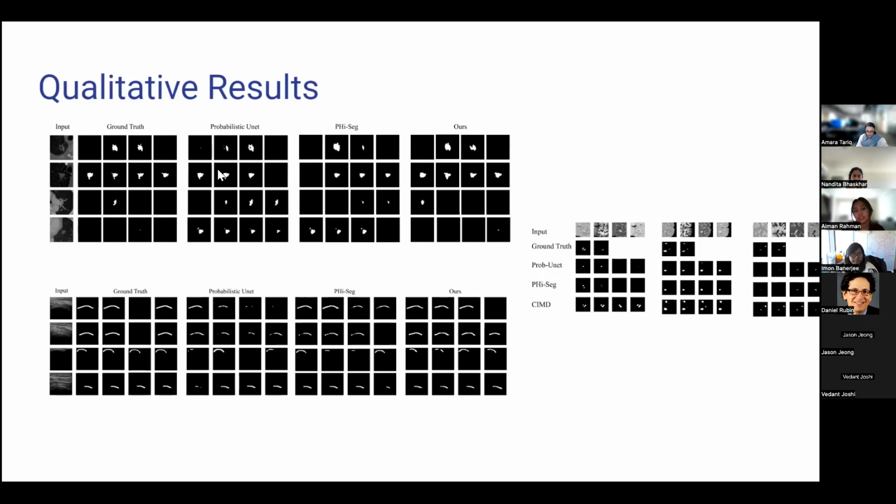One more thing is that in this case, none of the doctors produced a blank mask, so it is completely wrong to have a blank mask here. The frequency of blanks in the generation should also match how you have it in your ground truth. And sometimes you get disconnected masks as well, once you sample your variable Z, that you can see here or here.